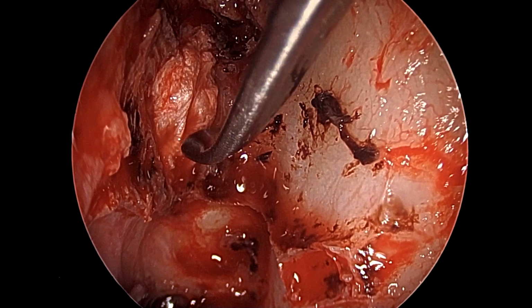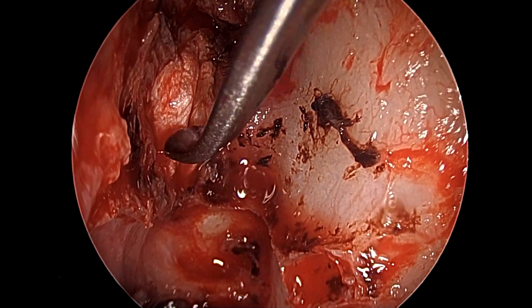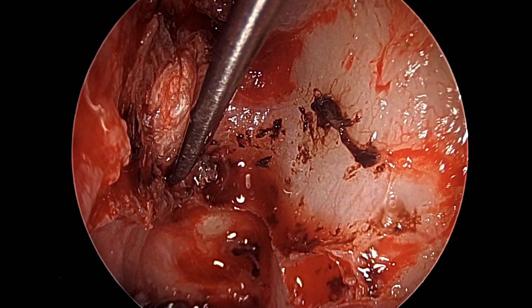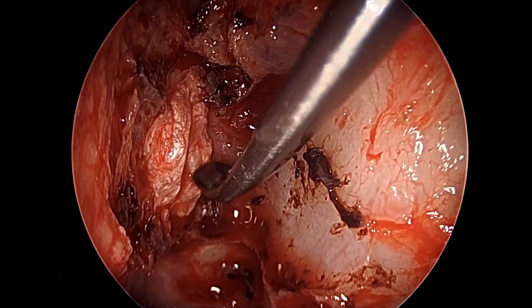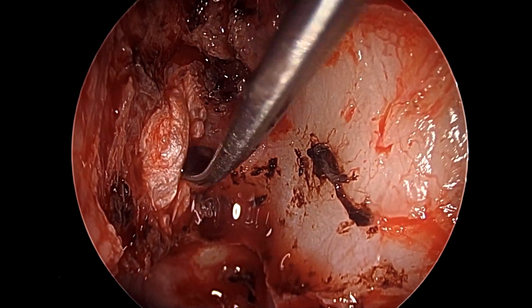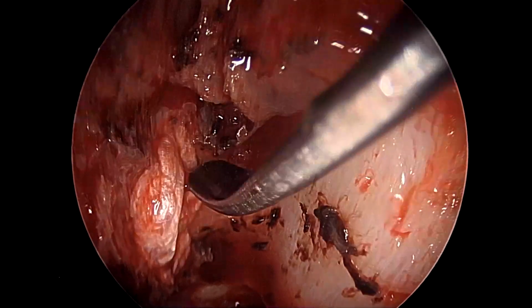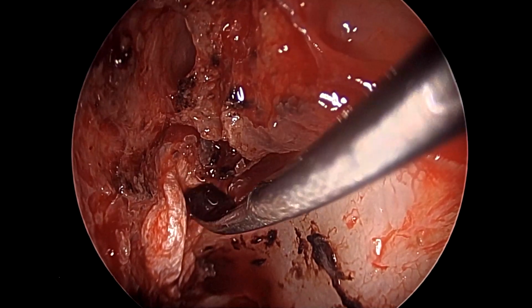As we see here, again we are using a 70-degree angle endoscope pointing upwards for a clear vision, and we use an angled elevator in this situation for gradually and slowly pushing the fascia lata within the boundaries of the dura and bone.